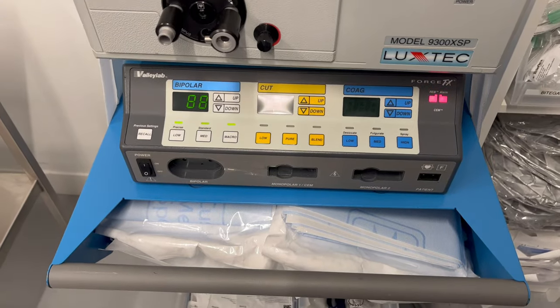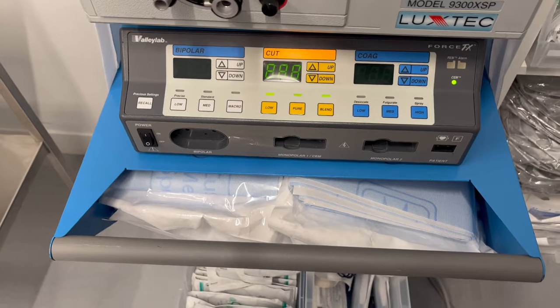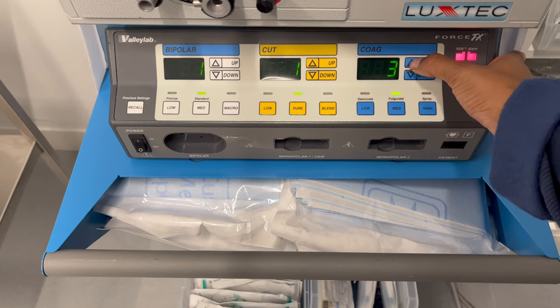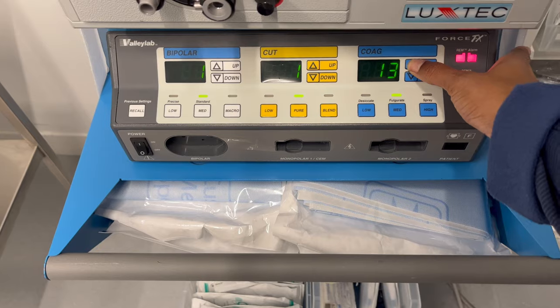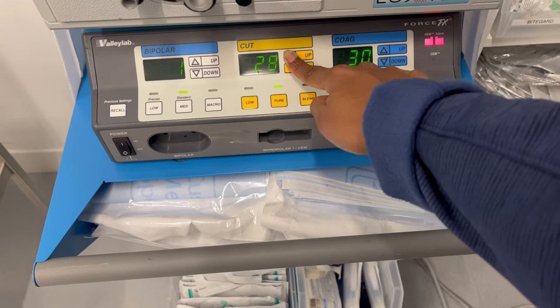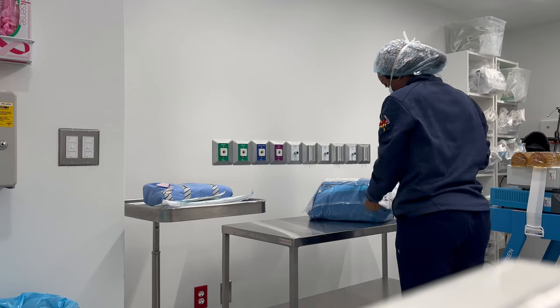And here's another thing that I do, is I turn on the Bovie machine to make sure the Bovie is working, and I set it to the surgeon's preference. So I know the surgeon's preference is 30-30. Usually everyone's about 30-30 depending on what you're doing. But I do that, because that's also something that my nurse doesn't have to do. It's a small practice, so my nurse is also the PACU nurse, and she's also pre-op. So she's dealing with the patient. So while I'm here, I just do that.